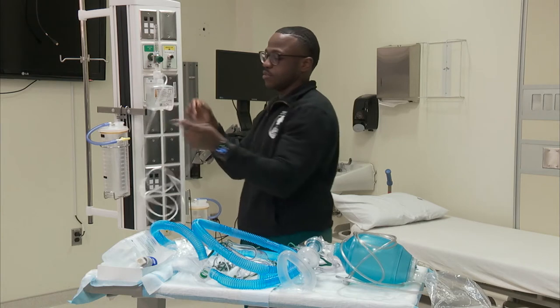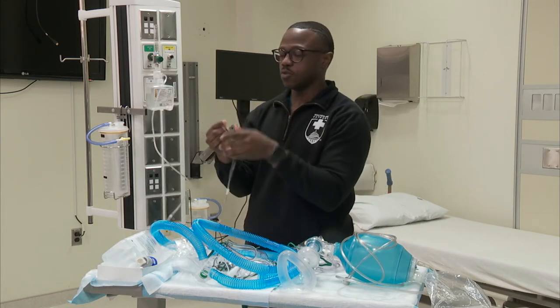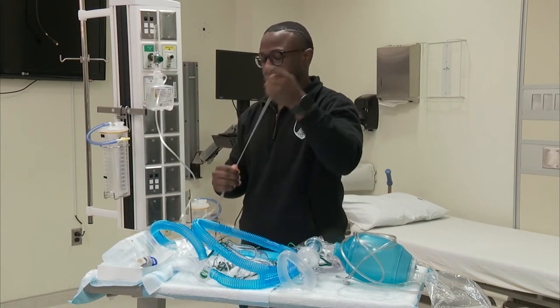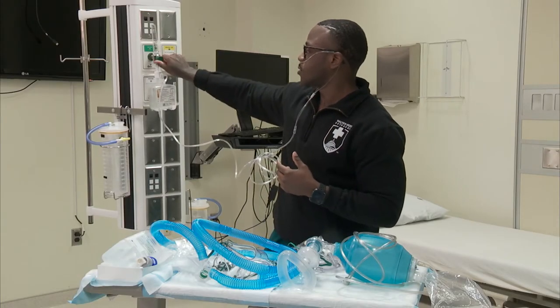I'm going to get my nasal cannula set. The cannula itself — you just want to make sure that the curvature follows the natural pathway of the nares. So you insert it in there, go around the ears, and then secure under the chin. You're maxed out at six liters per minute.